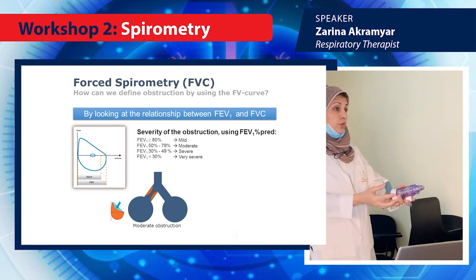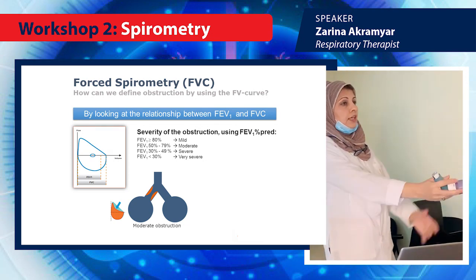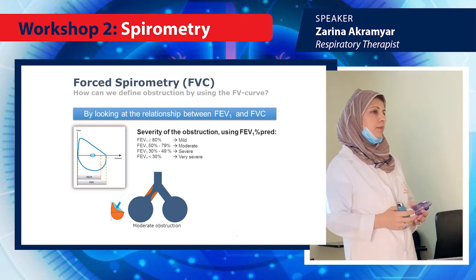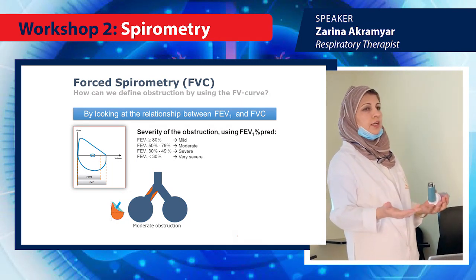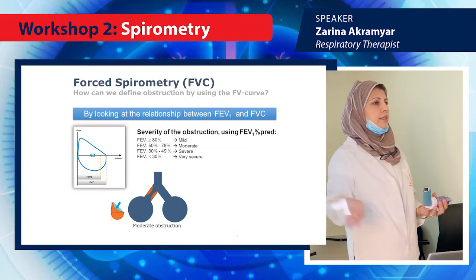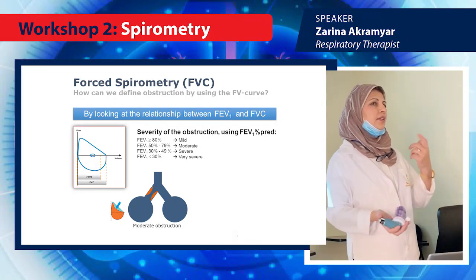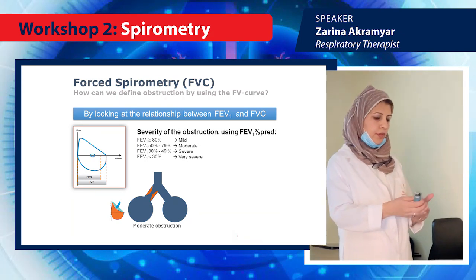See, you can do it on your own. Don't just give them the inhaler and say take your breath. Sometimes they come in the morning, they say I took my inhaler already. I don't trust the technique. Still I do spirometry and still I see obstruction. So I give it myself, because the way they do it, mostly people are wrong.